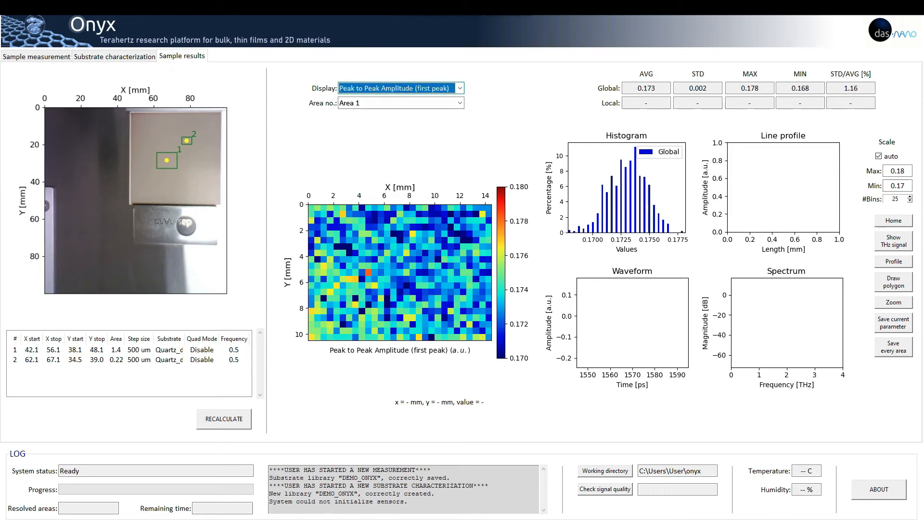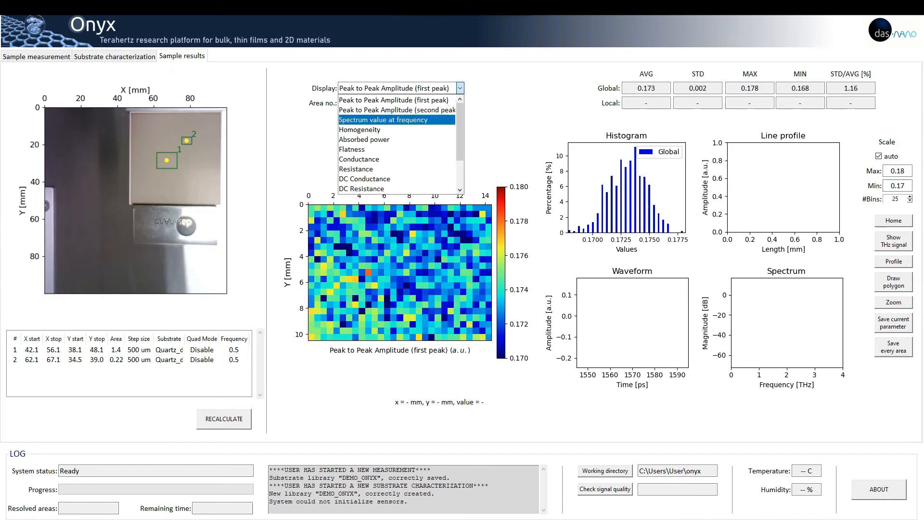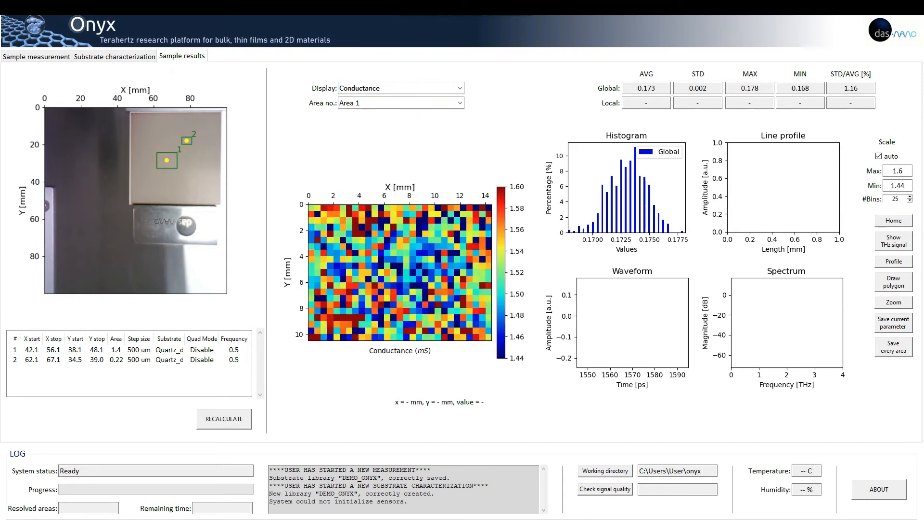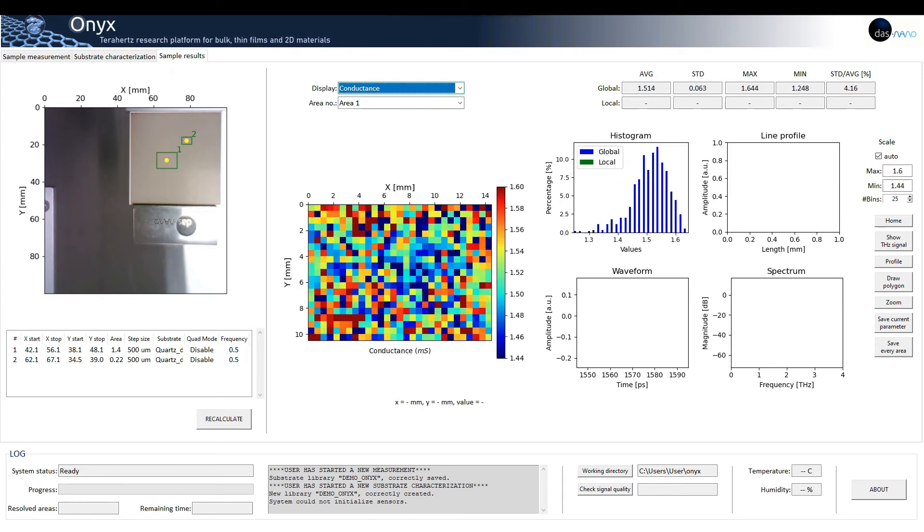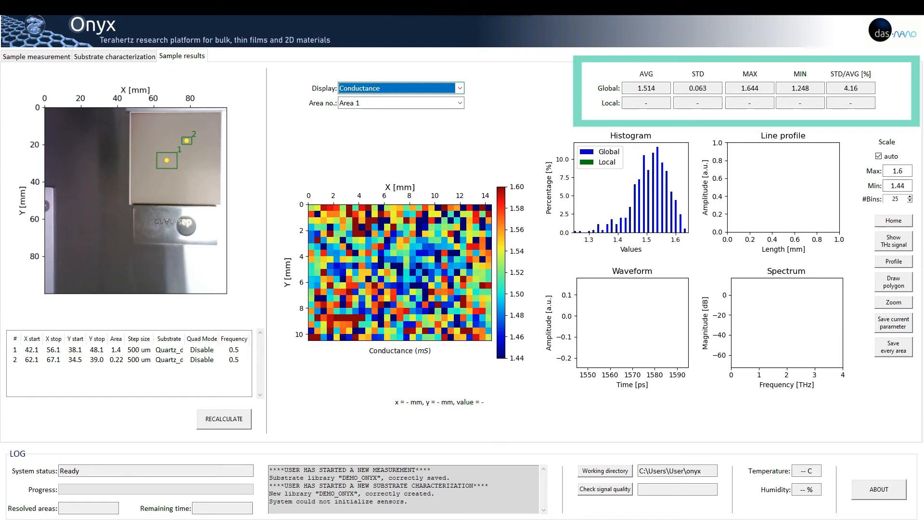For example, we can select the conductance 2D map. On the top right corner, the statistical values of conductance are shown, such as average, standard deviation, maximum, minimum and standard deviation over average in percentage.